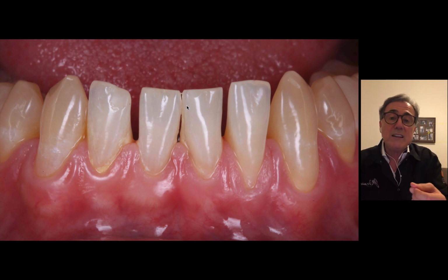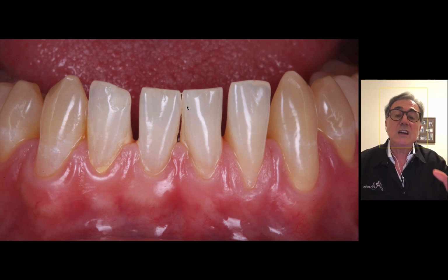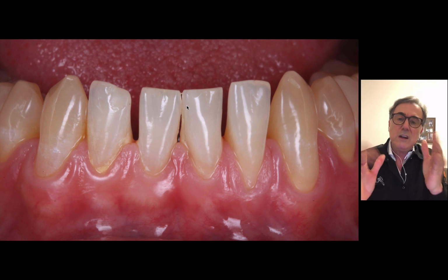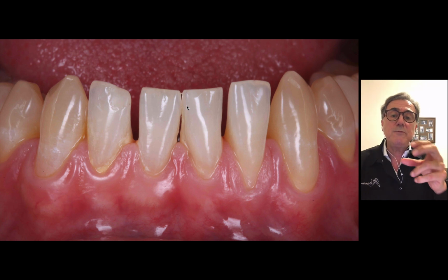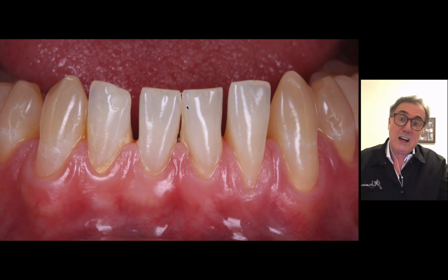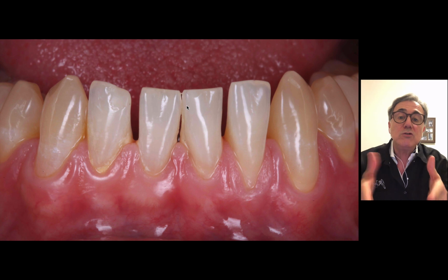It is a simplified composite system where you don't have all those 16 shades, a lot of shades. You have just 8 shades. It's a very restrictive number of colors, but they match very thoroughly the whole Vita shade guide with just 8 colors. And another thing, it's only a body shade. You don't have enamel and dentin and everything. It's just one composite. And that's what we're going to use to solve this case.